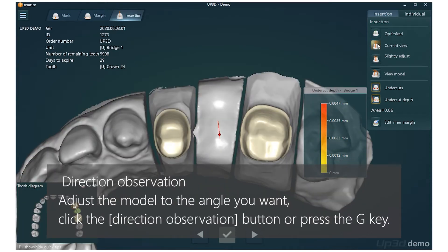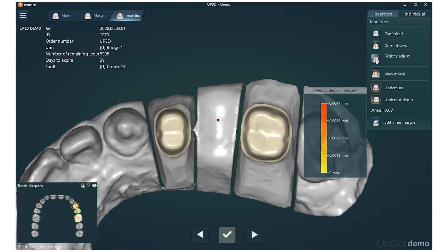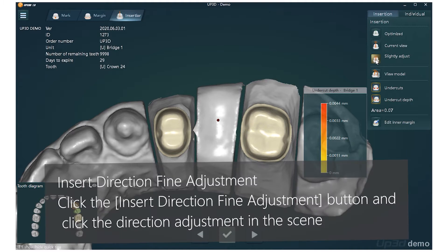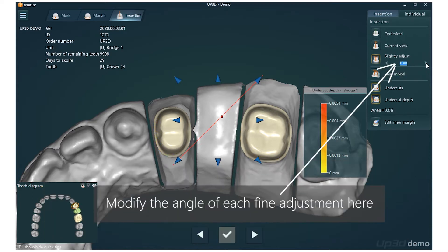Direction Observation: Adjust the model to the angle you want, then click the Direction Observation button or press the G key. Insert Direction Fine Adjustment: Click the Insert Direction Fine Adjustment button and click the Direction Adjustment in the scene. You can modify the angle of each fine adjustment here.